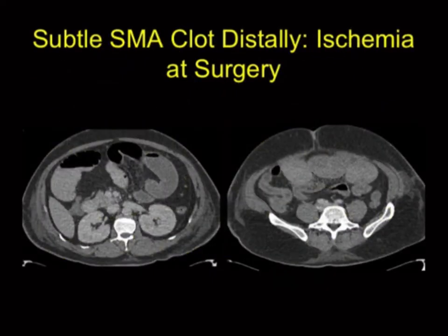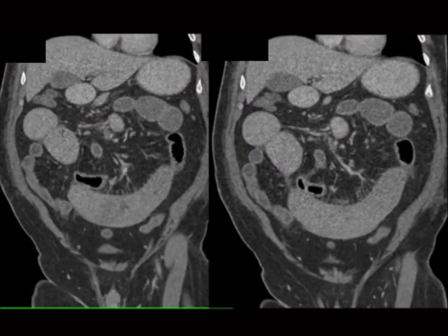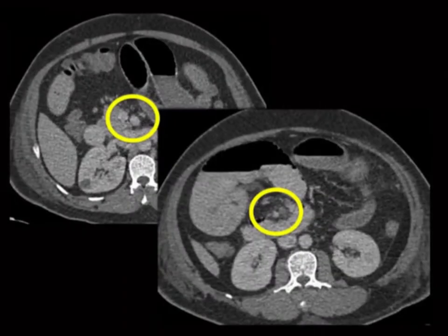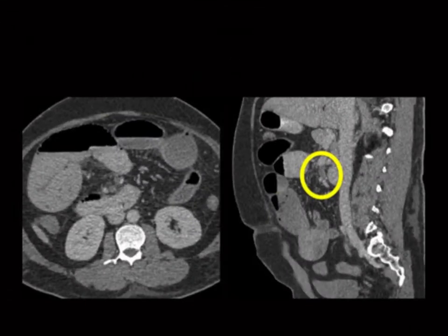Here's an example — an outside study, a legal case. The patient has dilated small bowel, you're worried about obstruction, and this loop of jejunum looks bad: thickened with prominent vasa recta. You have to worry about ischemia. They reported this as dilated but didn't mention anything about ischemia. Looking at the vessels — not the greatest injection — in the first image you see the SMA and SMV, but in the second image the SMA is clotted. It's subtle. If you go back and reconstruct on the sagittal view, there's the thrombus.